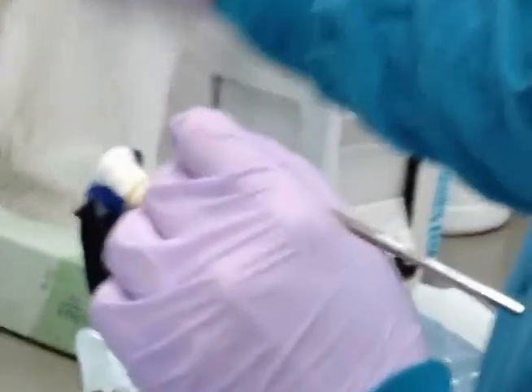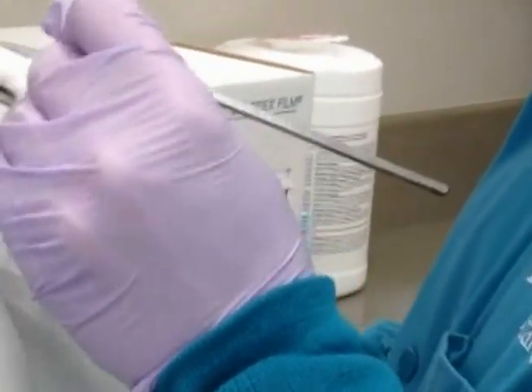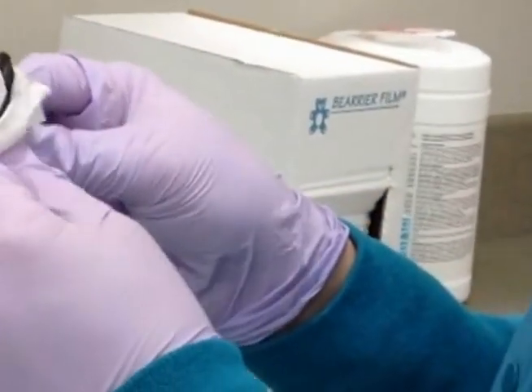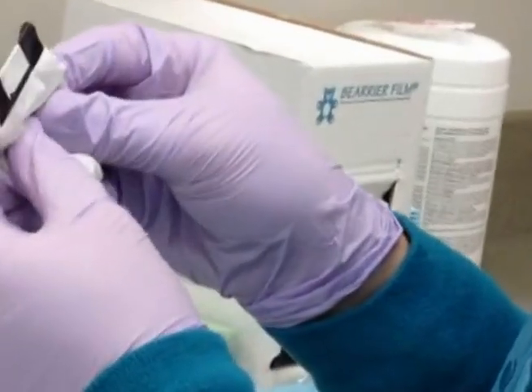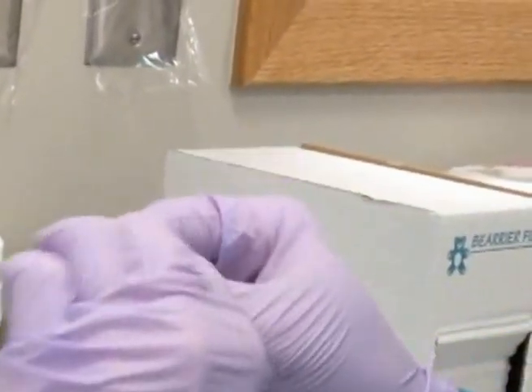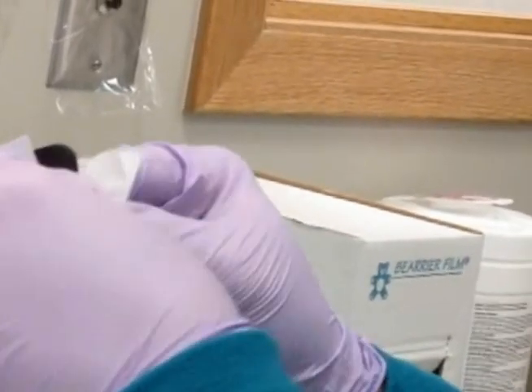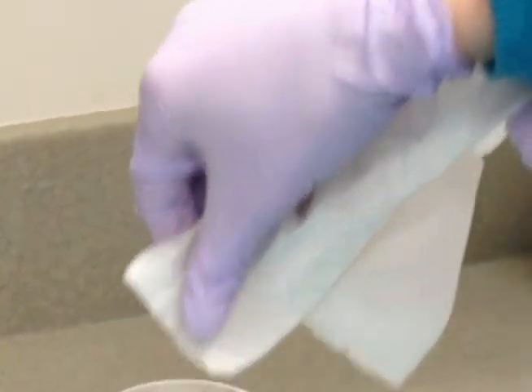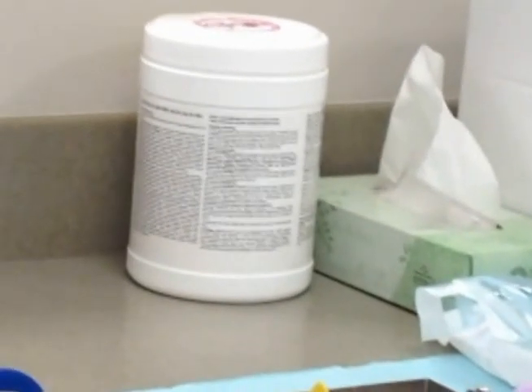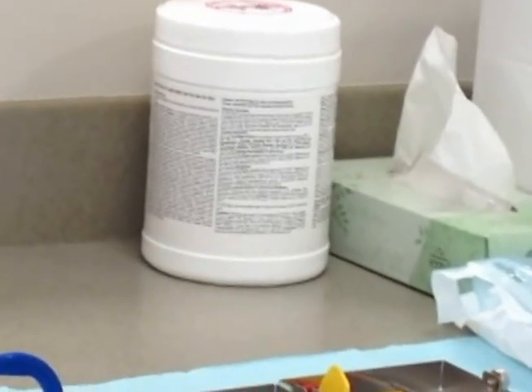Using a tissue, remove the film from the bite block and wipe it off. Now that the film is dry, place it in the Dixie cup, making sure not to touch the cup. Also make sure to remove the tabs if you have used them. The film can now be developed and evaluated. If the radiograph is acceptable, you will instruct your patient to wait in the chairs while you clean up your unit.